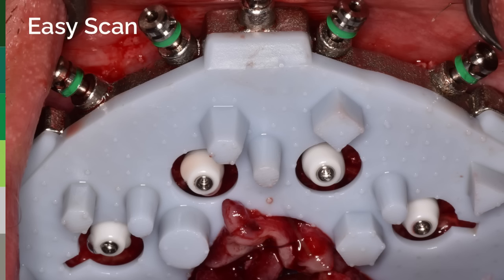So what we're offering is a simple scan. You scan a surface that is probably clean, maybe a little bit bloody, but probably clean. It has geometries on it that are non-repeating so that the scanner can simply flow from left to right.